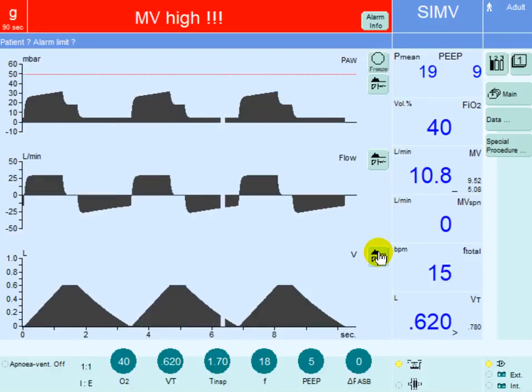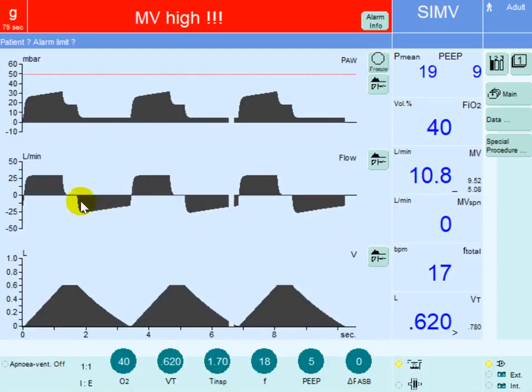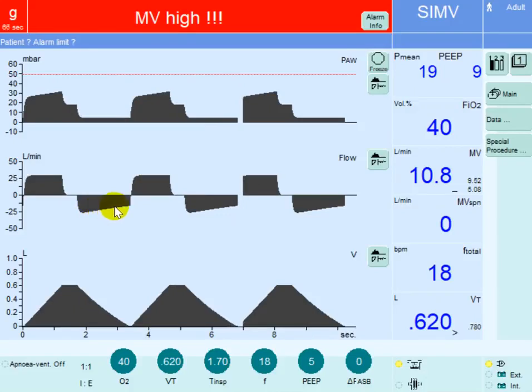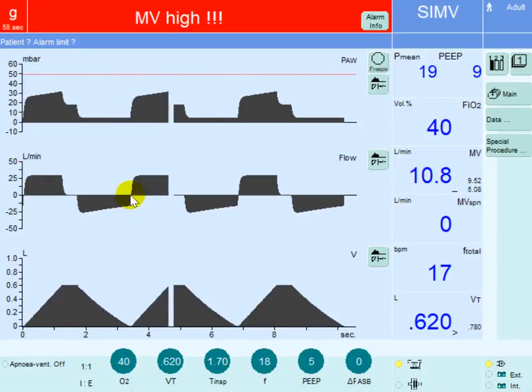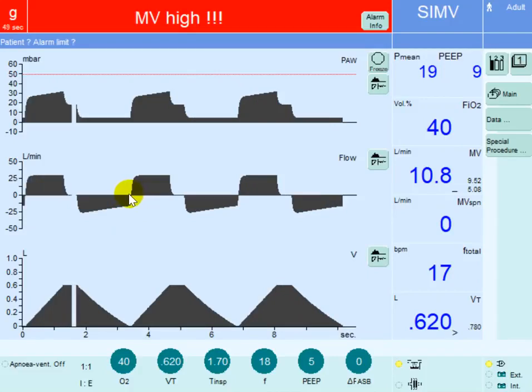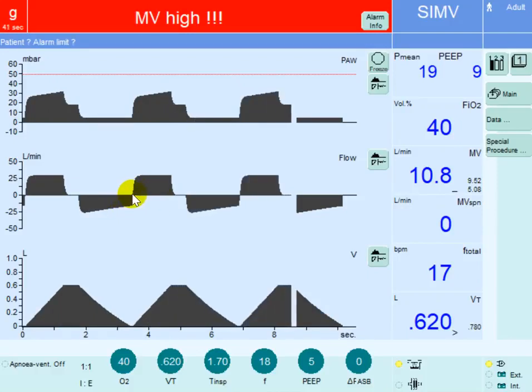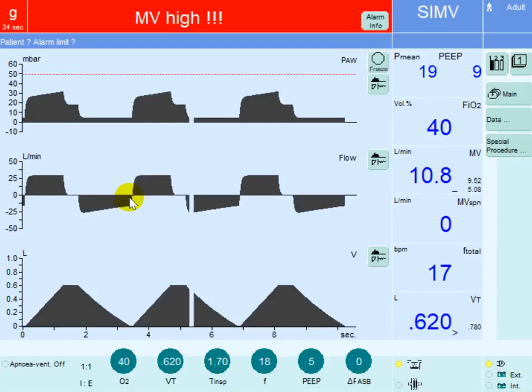His pH is 7.48 and pCO2 is 30. When you analyze his ventilator graphics, you can easily appreciate that in expiration the expiratory flow is limited, with decreased peak expiratory flow. The expiratory flow does not reach the zero point at end of expiration, so there is a persistent flow at end of expiration. Notice that the next breath starts before we empty the lung completely — that means there is air trapping inside the lung, which has hemodynamic consequences if it accumulates further.